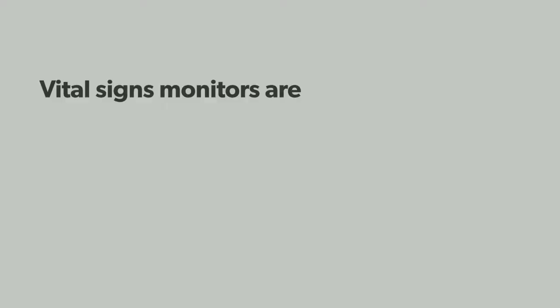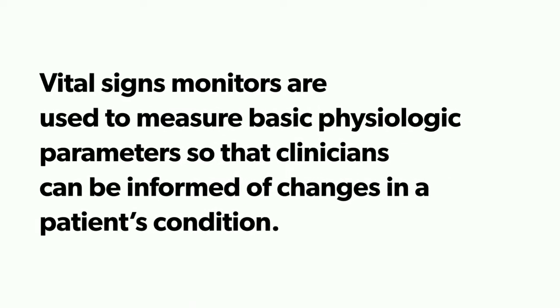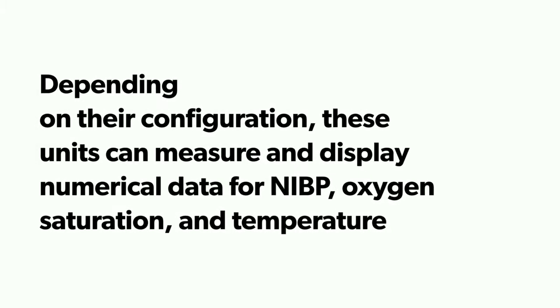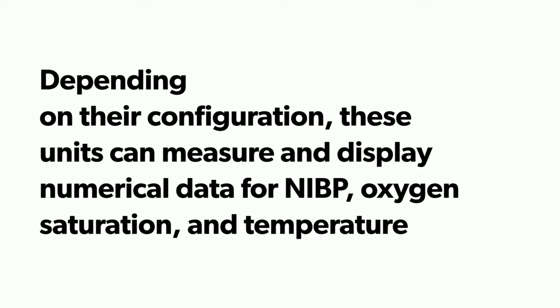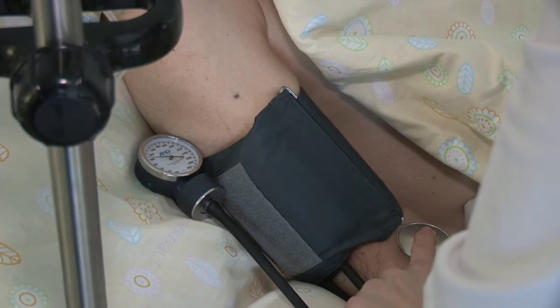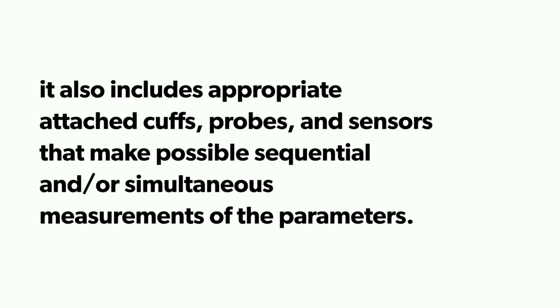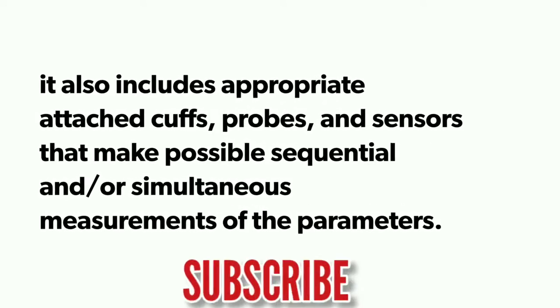Vital sign monitors are used to measure basic physiologic parameters so that clinicians can be informed of changes in a patient's condition. Depending on their configuration, these units can measure and display numerical data for NIBP, oxygen saturation, and even temperature. So what does this machine look like? It is an automatic electronic sphygmomanometer that non-invasively measures and displays a patient's arterial blood pressure. The main unit includes the controls and display. It also includes the appropriate attached cuffs, probes, and sensors that make possible sequential or simultaneous measurement of the parameters.